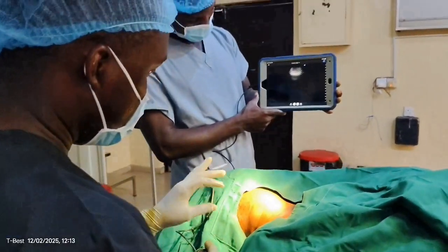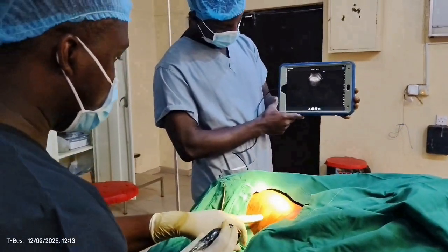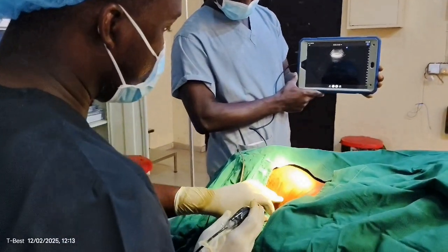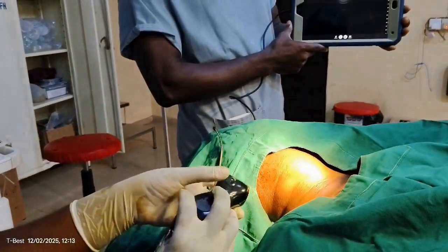What I want to do for this patient is an intermediate cervical plexus block, which I'm going to use for this thyroidectomy. I've really infiltrated this area, and this area is the midpoint of the posterior border of the sternocleidomastoid head — like the mastoid. So we're going to use an in-plane technique.